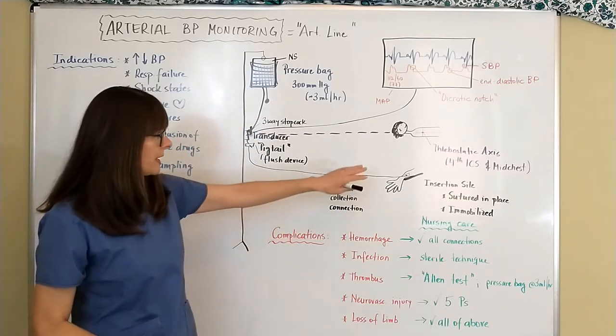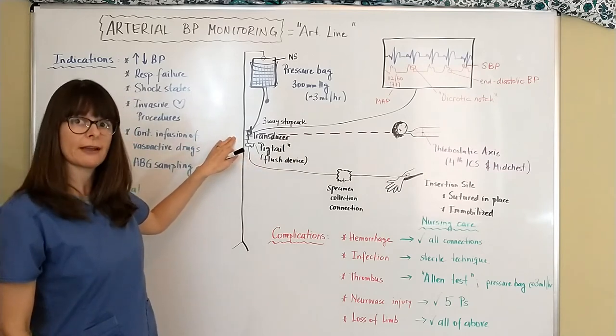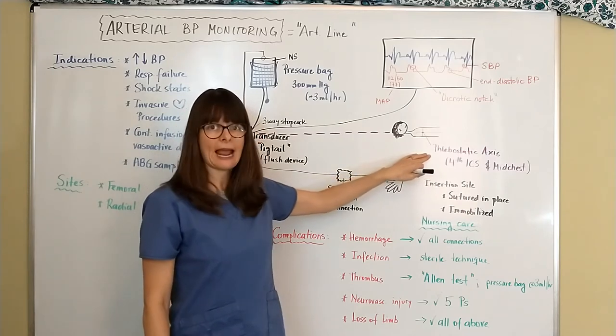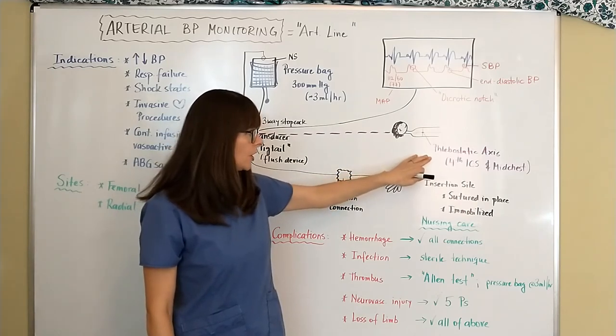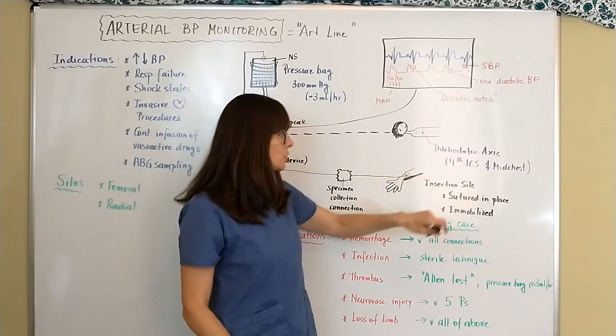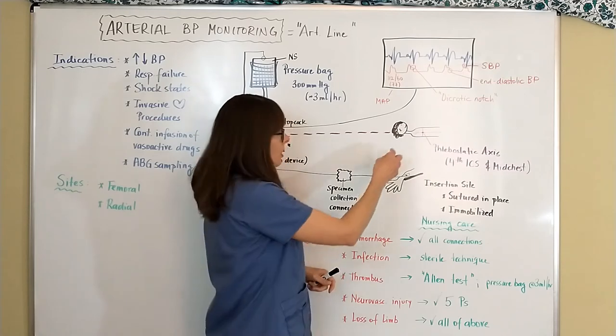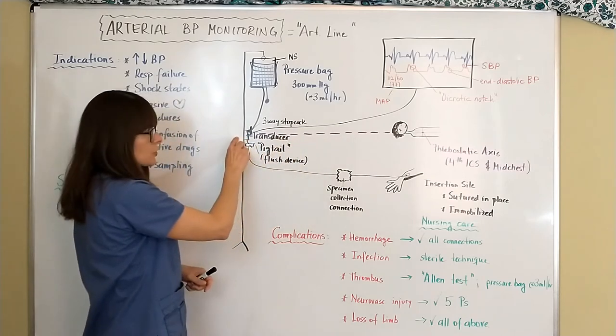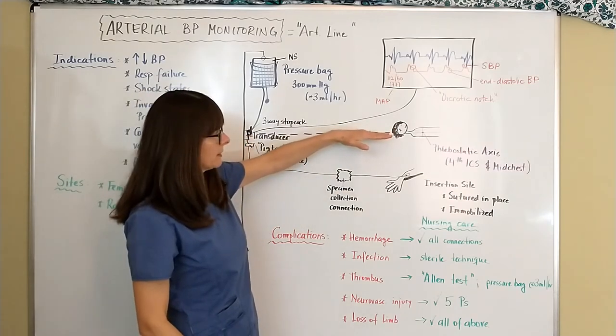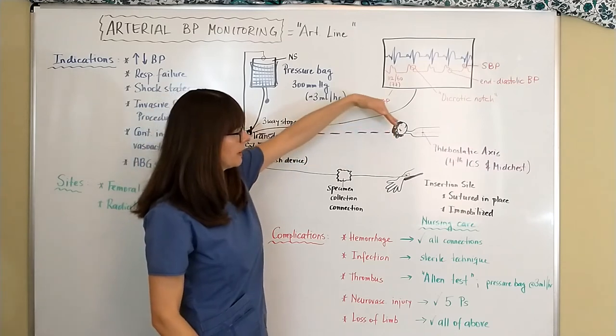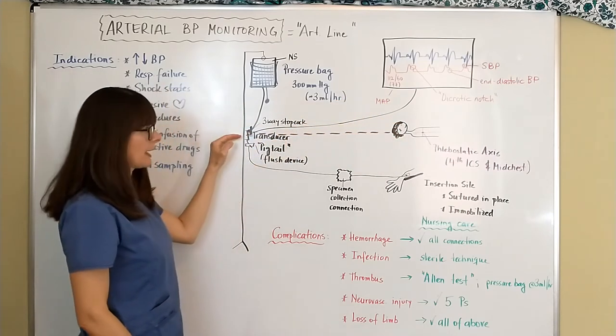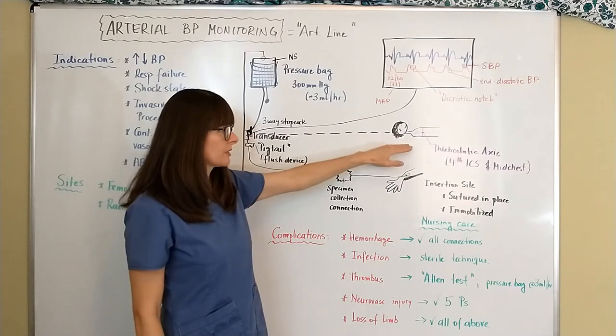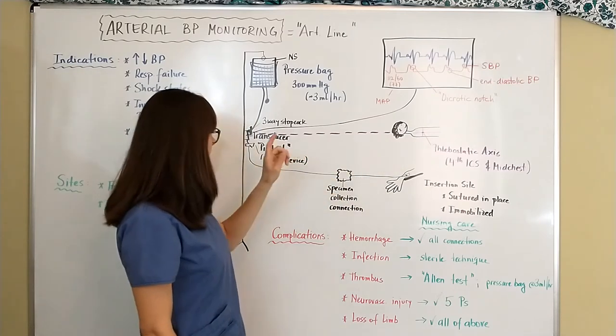Now let's look at our patient. So the transducer that we have attached to the IV pole here needs to be lined up with what's called the phlebostatic axis and the landmarks for that are the fourth intercostal space and the mid chest. So you would march down the fourth intercostal and then find the mid chest of the patient and line this up with the transducer. If the patient's bed gets elevated or lowered or the head of the bed moves up or down, this will no longer be lined up and will not give us accurate results.